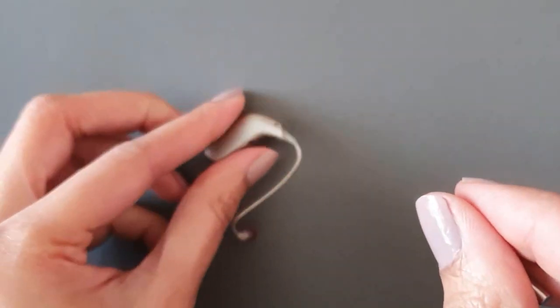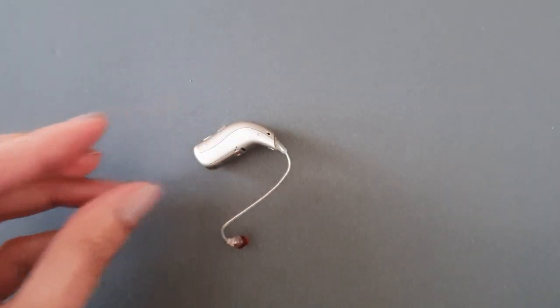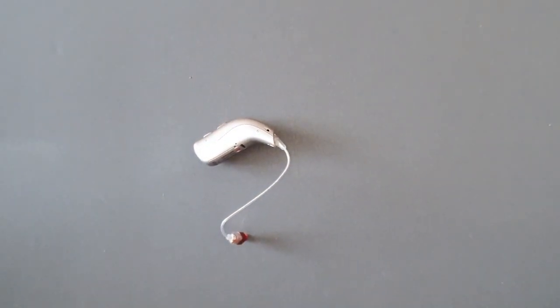And that's how you change the speaker wire for your Bernafon Viron hearing aids. Thank you.